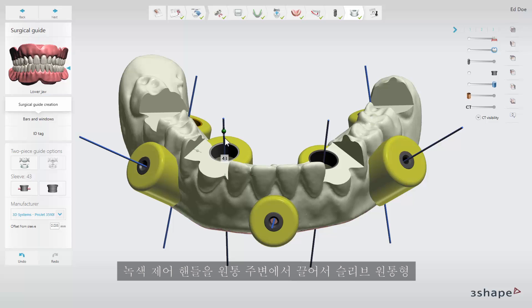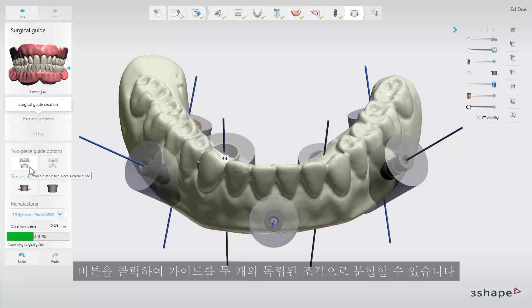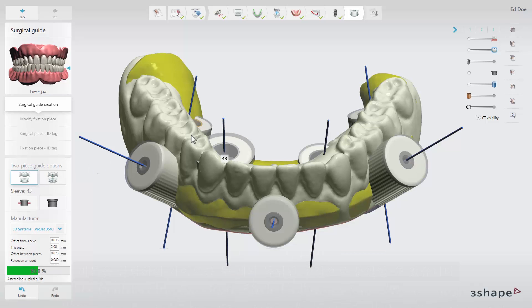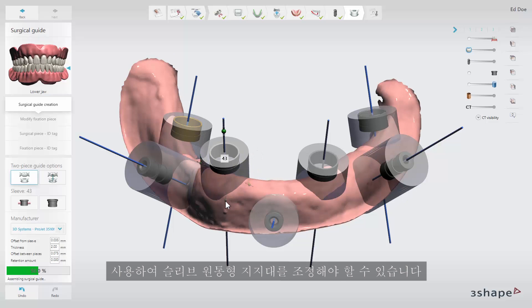You can change the height and diameter of the sleeve support cylinders by dragging the green control handle around the cylinder. Under two-piece guide options you can split the guide into two separate pieces by clicking the enable/disable two-piece surgical guide button. After enabling the two-piece guide option it may be necessary to adjust the sleeve support cylinders using the green control points.